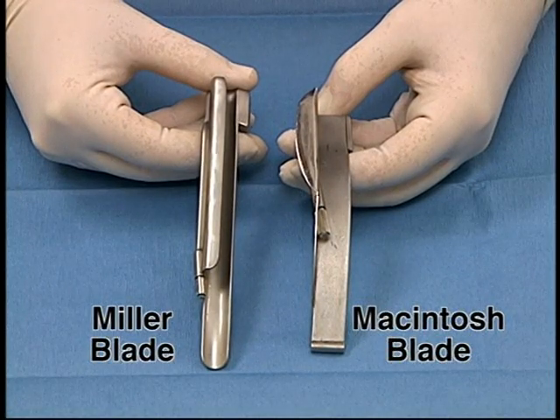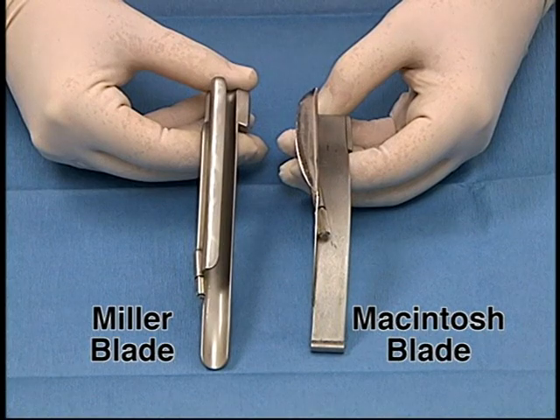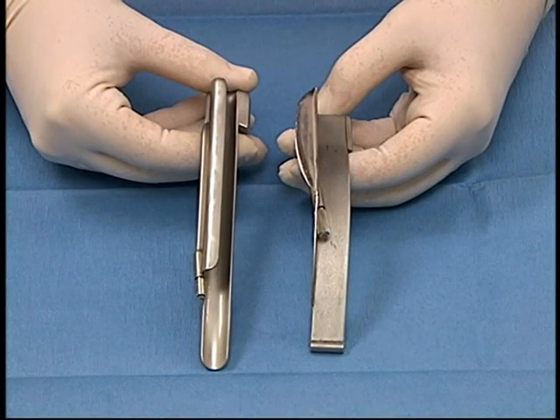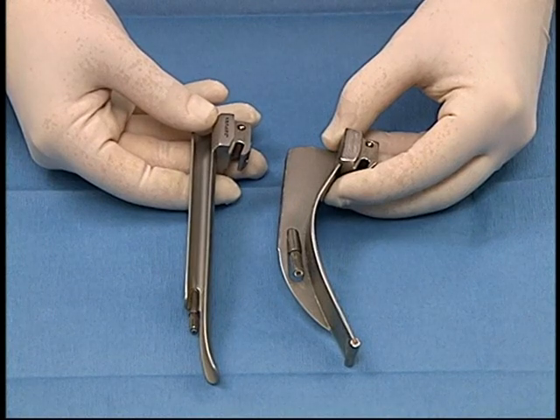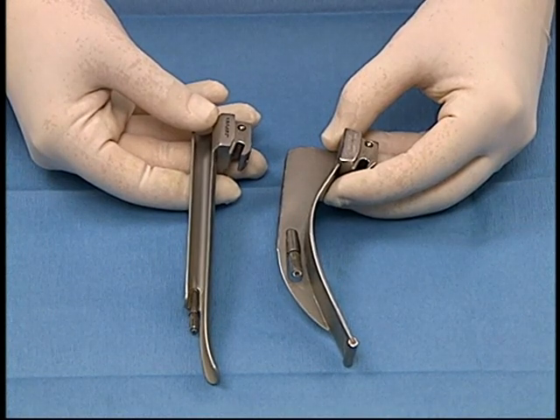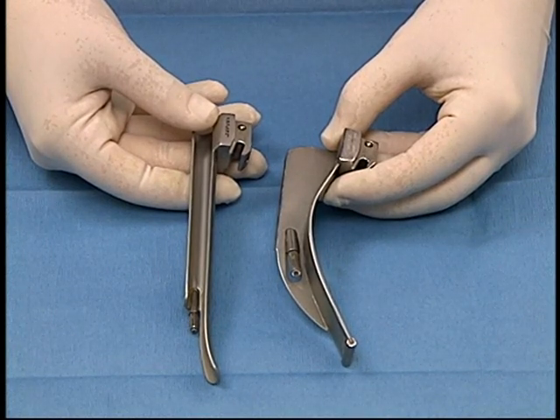Miller and Macintosh blades are available for use with a laryngoscope. The Miller blade is more useful, as it is long and narrow and should be placed over the top of the epiglottis. The Macintosh blade is broad and round, should be placed beneath the epiglottis, and the epiglottis should be pulled down.